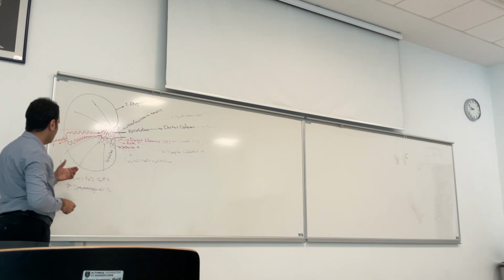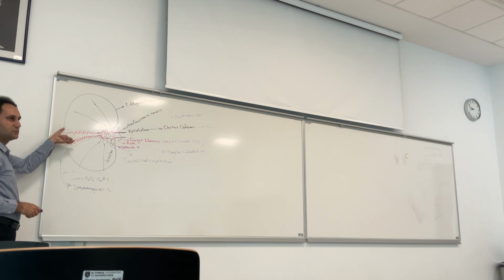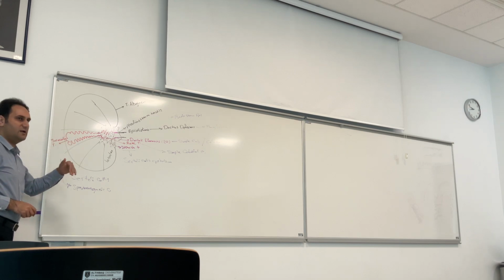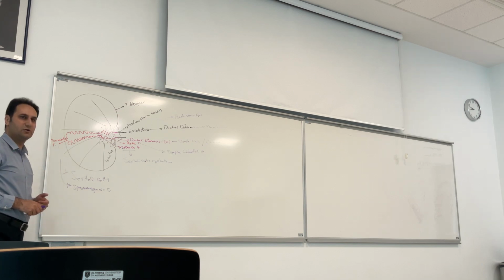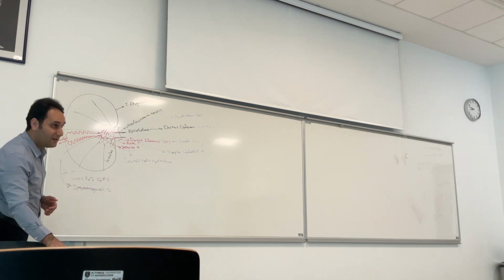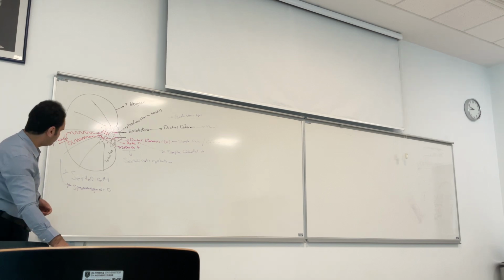Now, we are going to talk about the inner side of the testis lobules. In the inner side of the testis lobule and in the outer side of the seminiferous tubules, we have interstitial tissue, in this part.